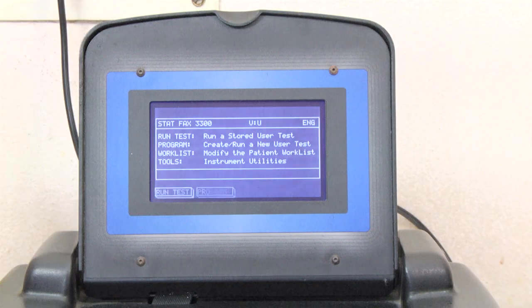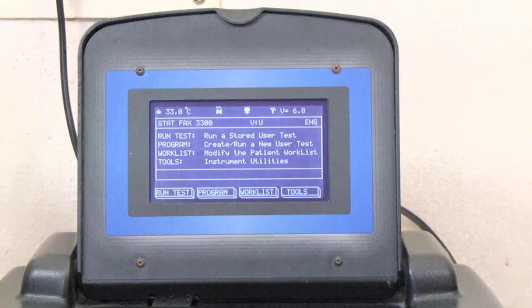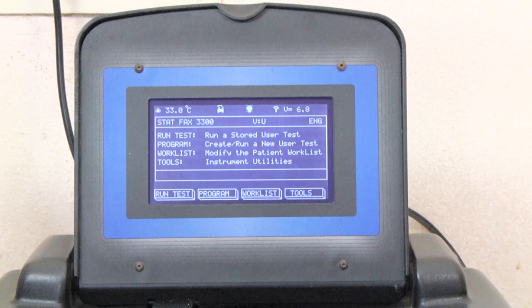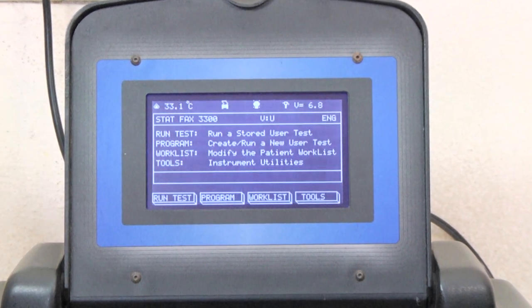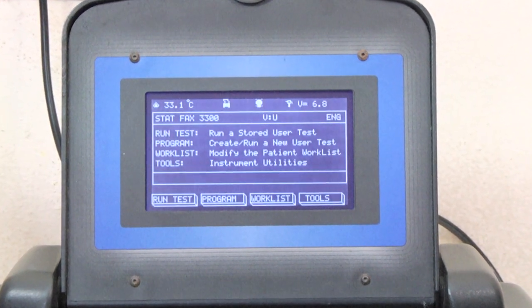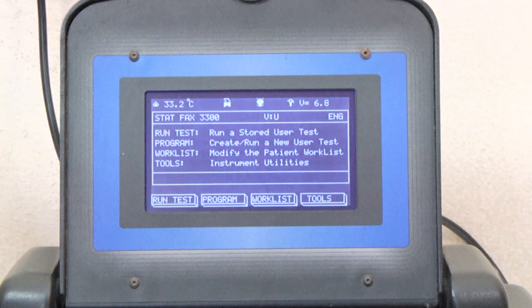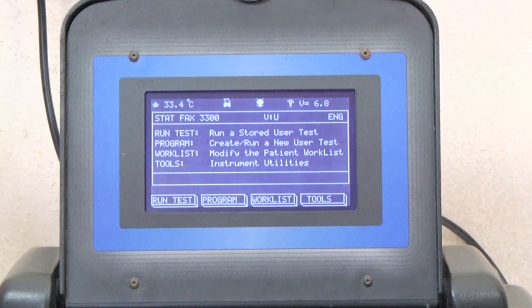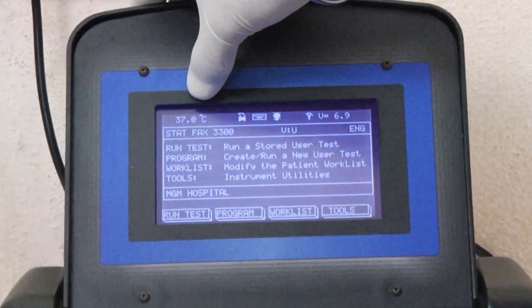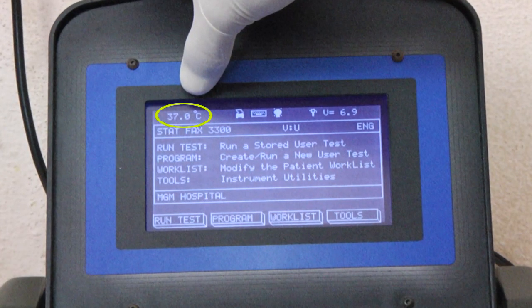Place the power switch to the on position. The display will usually show information regarding the instrument model, review software, laboratory name, date and time, which can vary with different instruments. Allow the instrument to equilibrate for 15 minutes. The cell temperature is controlled at 37 degrees Celsius by software.